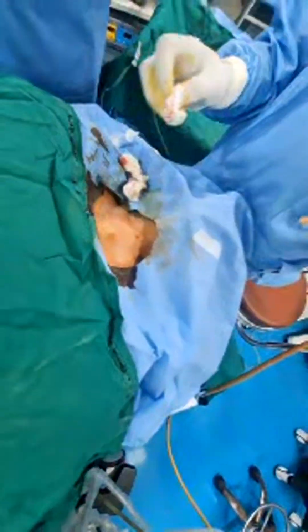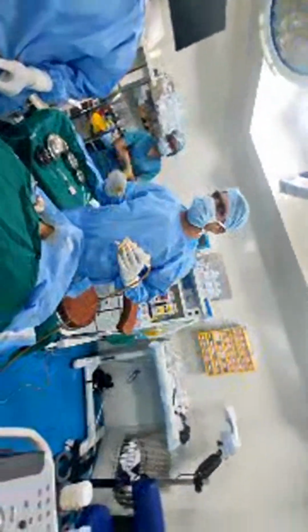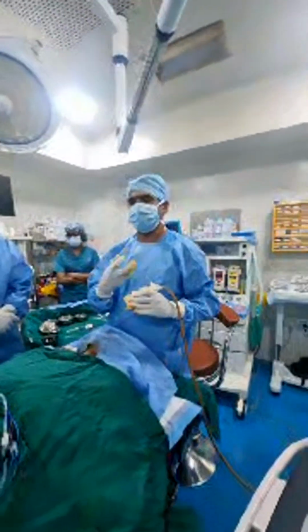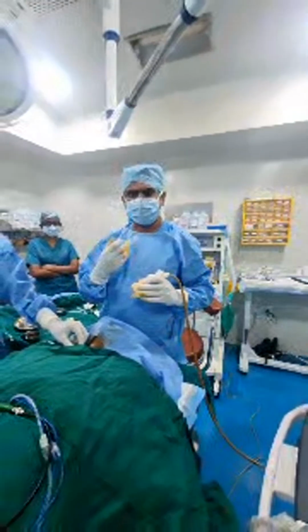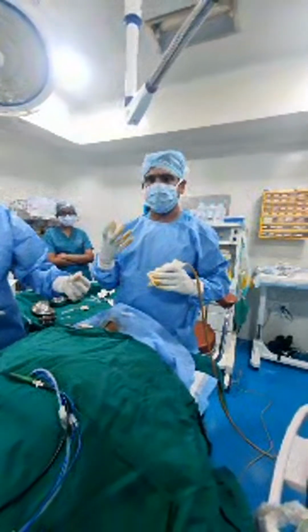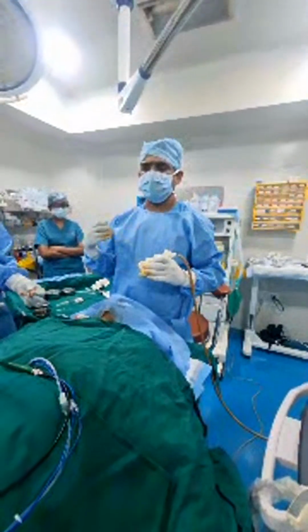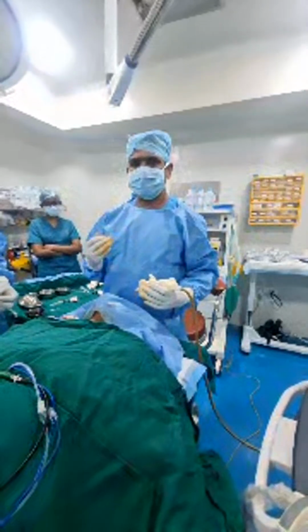Okay, thank you. So this is a non-surgical technique where there is no cut or incision. We can completely cure the thyroid or goitre, whatever acquired swelling. Especially it occurs in women and young females because thyroid problems come in women more commonly. So we can treat them. If it is a tumor, it's a different treatment. If it is a cancer, it's a different treatment. Non-cancerous nodules, which are swellings, can be cured without any surgery, without any cut, using this.